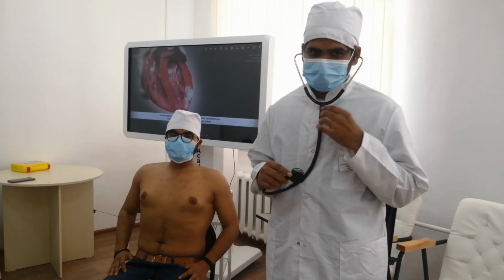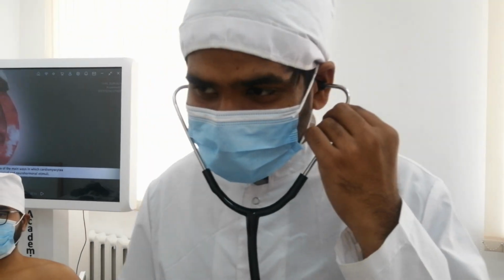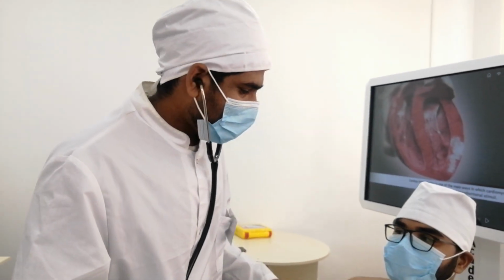Hello, today we are practicing auscultation of the heart. This is our student. Please name. Sasidharan. Your group number? 226. Okay, please start. How many points do we have? We have 5 points. First point?